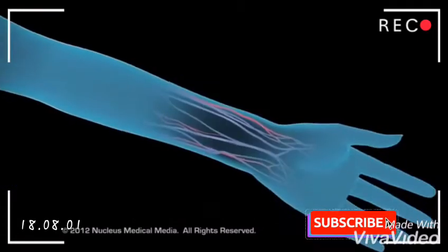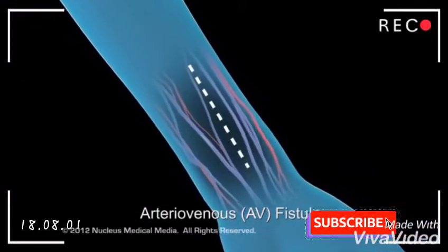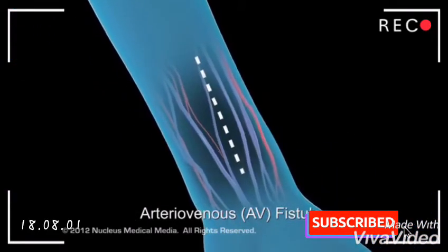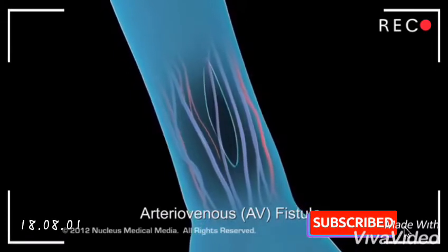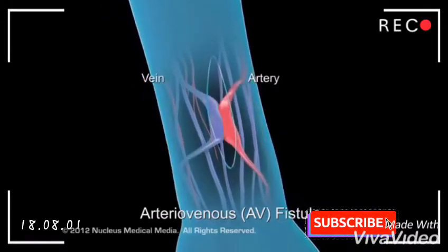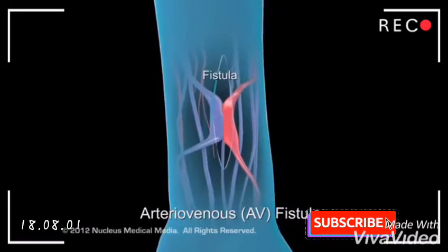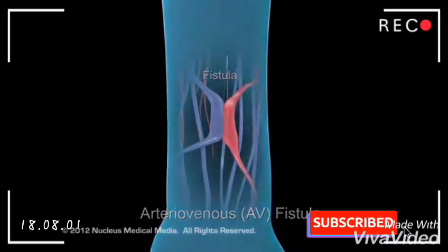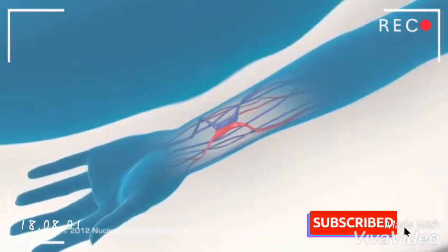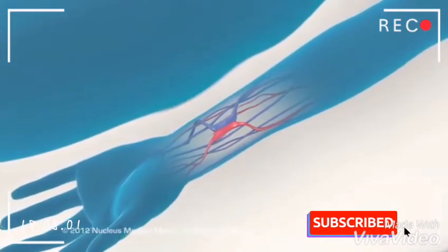To create an arteriovenous fistula, the surgeon will make a small incision in the skin and connect an artery with a vein to make a larger vessel called a fistula. Once the vascular access site has healed, the doctor can start hemodialysis.